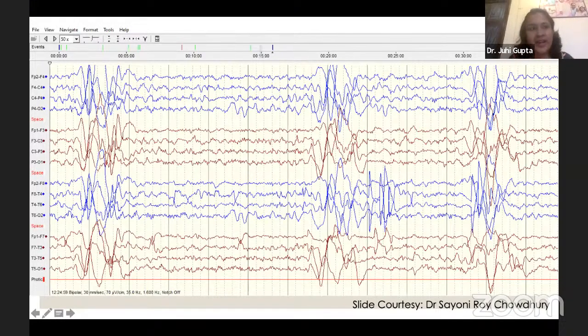can participants try to look at the EEG montage, and can they try to type in what sort of montage this is? FP2, F4, F4, C4. While I describe, you can try to type in the montage if you have already identified it. In this 10-second epoch, you are seeing these slow wave complexes, 1, 2, and 3. If you want to look at periodicity, whether they are actually coming at quasi-periodic intervals, then you can try to reduce the paper speed.